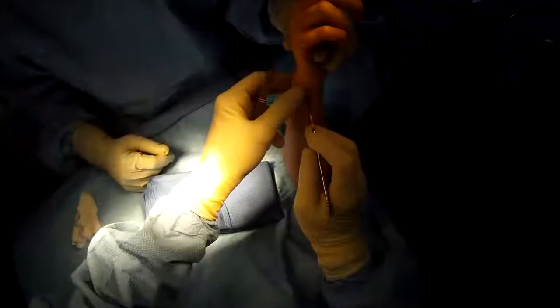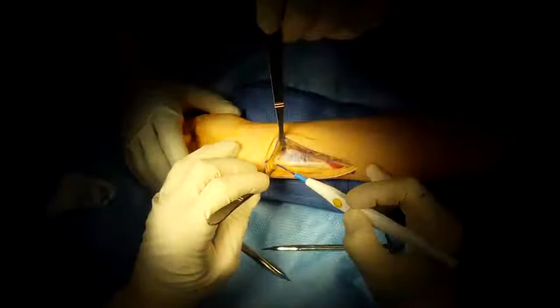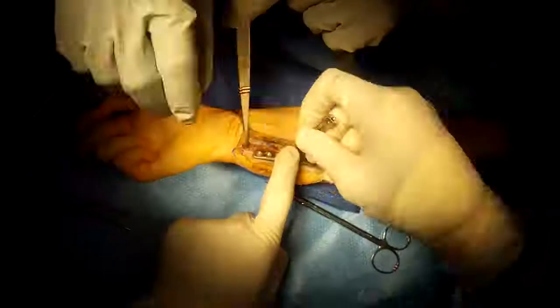Ulnar Shortening Osteotomy. Make an incision on the ulnar side of the forearm, dissect down, and place retractors. Shortening the ulna, which we're dissecting out here.